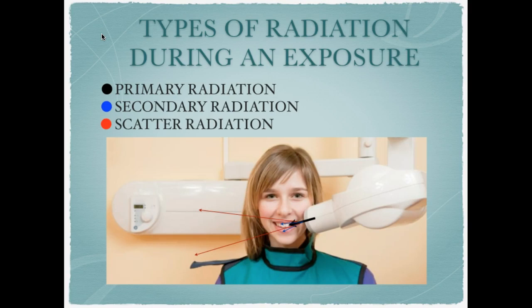Now, once again, we do not need to be afraid of radiation. We just have to work smartly with it. So if you have your PID, as in this picture, directed toward the patient's teeth, which is the purpose of us taking radiographs, an image of the teeth and the internal structures of teeth, then you have some secondary radiation, as well as some scattered radiation, which is minimal.